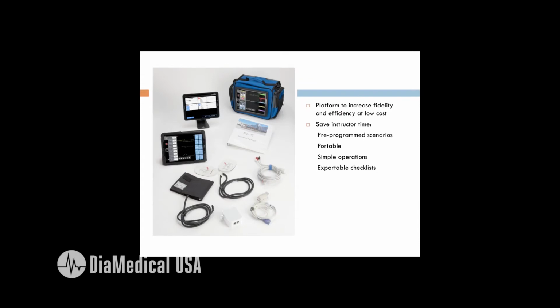SimVS has been designed as a comprehensive platform to allow instructors to increase the fidelity of their simulations and also to provide efficient simulation operations at a low cost. The way the scenario saves instructors time is through a library of pre-programmed scenarios, validated as well. The system is portable, easily set up, allowing for simple operations through either the pre-programmed scenarios or on the fly.